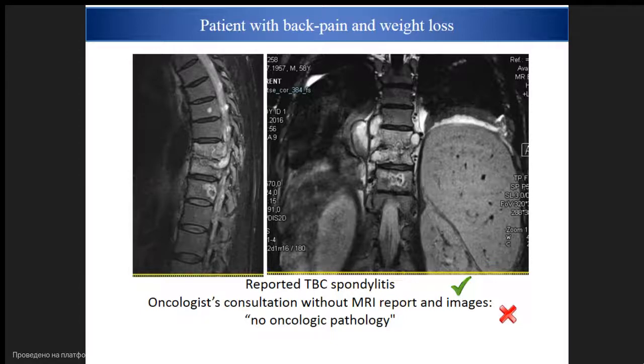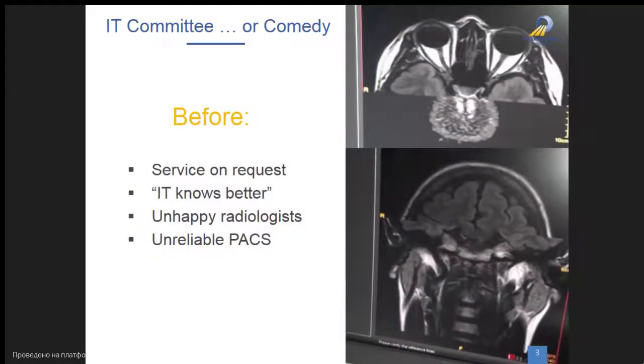So the images are very important, and if they were available through the PACS, through the RIS, at the time of the clinician's consultation, the fate of the patient would have been completely different. The patient has finally died in just several months without proper diagnosis. The communication of radiology results with clinicians is pivotal, and the information systems are very important to facilitate this cooperation.